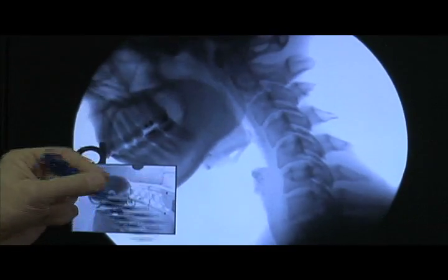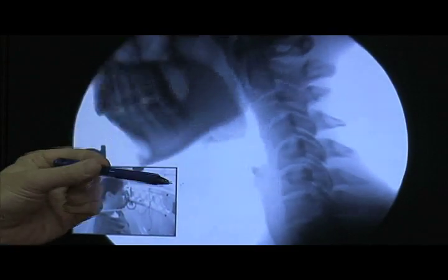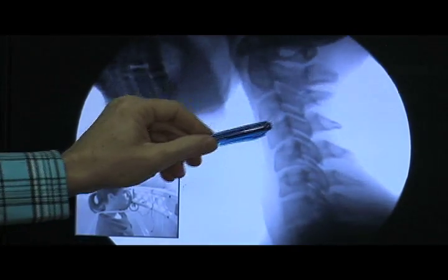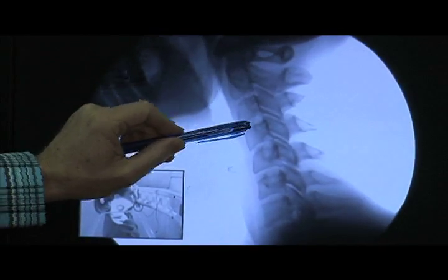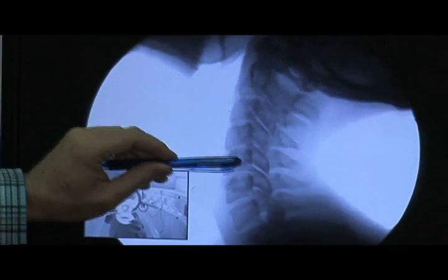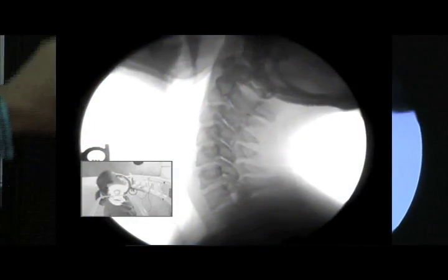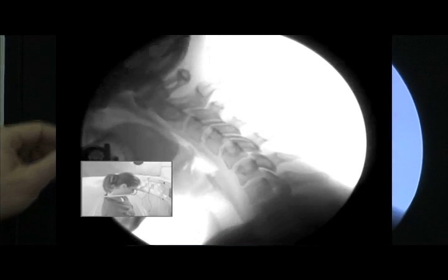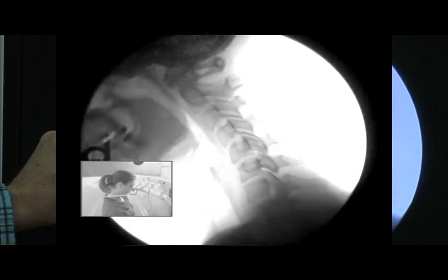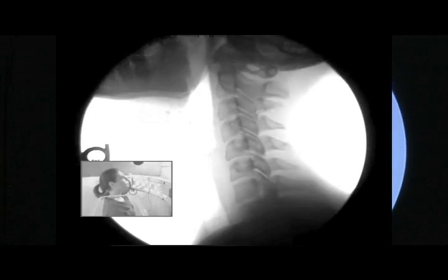You can see here that there's a space between each bone. Each bone has a disc space between. That's the light cutting out. It's not me doing anything. Now they're looking back, extending their neck. You can see the curve in the spine. It's tilting forward to its maximum flexion as each bone moves and slides over the other one.